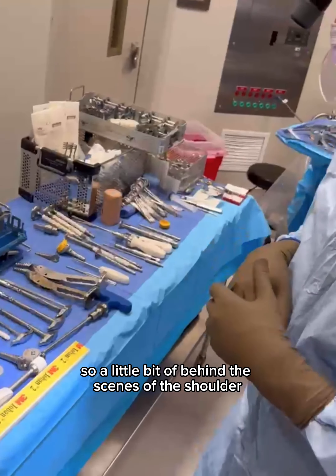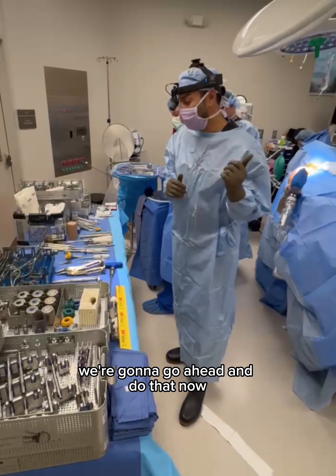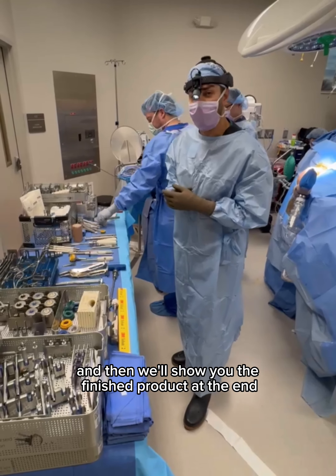So a little bit of behind the scenes of the shoulder reverse total shoulder arthroplasty. We're going to go ahead and do that now and then we'll show you the finished product in a minute.